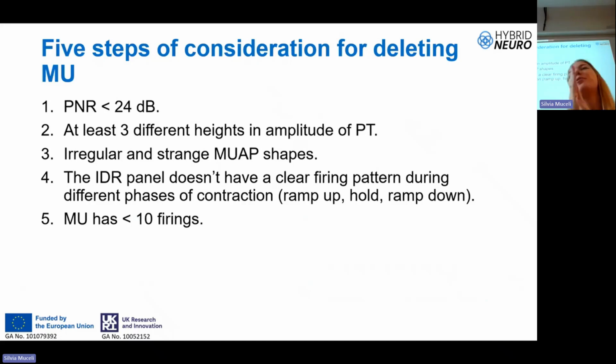Who was your mentor when you were learning how to edit the motor units, how to edit the results of the decomposition? I guess you are all familiar with the phrase, just be brutal. Even though we have some experimental protocols and we were able to identify a small amount of motor units, we still need to be brutal and delete motor units that are identified with poor accuracy.